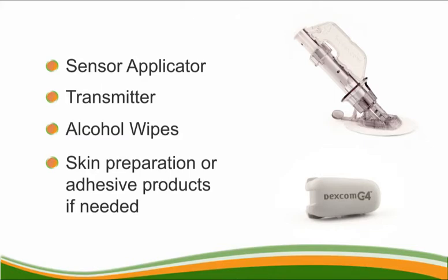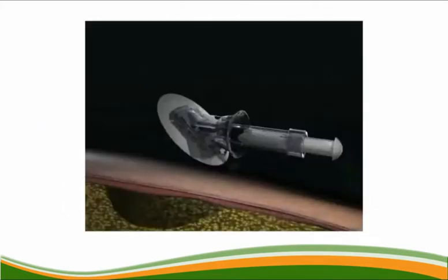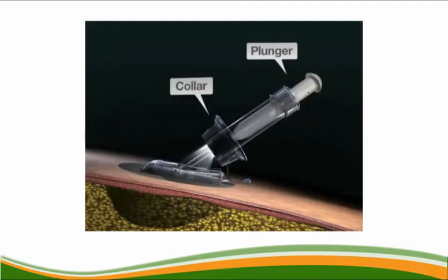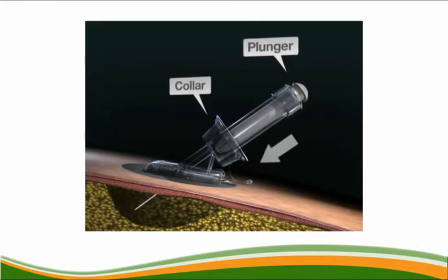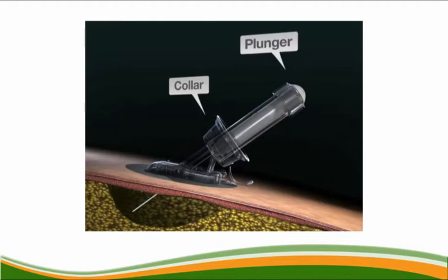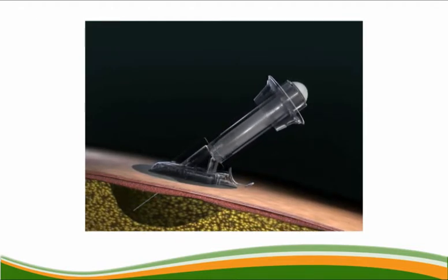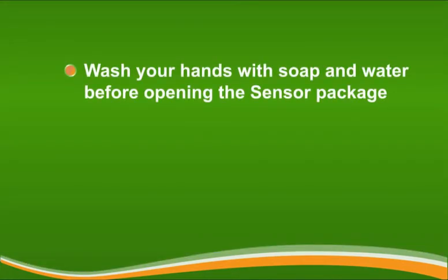Your first sensor insertion may not feel natural, but once you have done it once or twice, it should become more familiar. The process of inserting the sensor is as follows. On the applicator barrel, the white plunger inserts the introducer needle and sensor under your skin. When the collar is pulled back completely, the introducer needle is removed and the tiny, flexible sensor remains under your skin. First, wash your hands with soap and water before opening the sensor package.